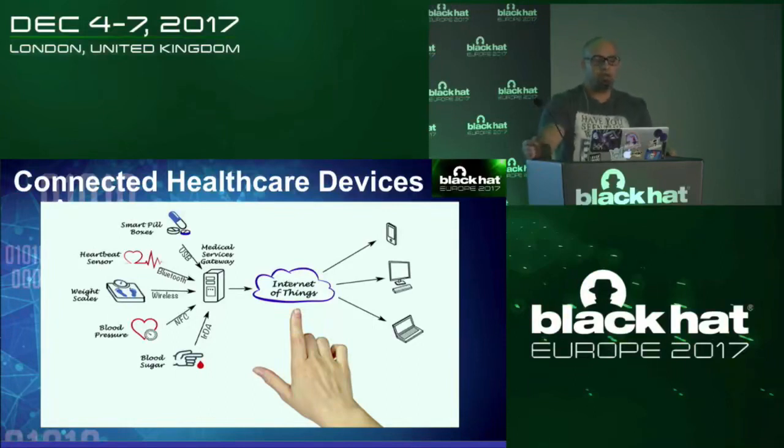And these devices can talk on a lot of protocols. So they can talk over Wi-Fi, cellular data, so 3G, 4G, LTE. They can talk different protocols like Zigbee, Z-Wave, etc. So for example, your Apple Watch talks to your iPhone over Bluetooth. Or say, for example, if you have a Fitbit weighing scale that can connect to the cloud infrastructure and share data with it over Wi-Fi. An insulin pump or an infusion pump in a private hospital connects over Wi-Fi or wired connection, so on and so forth.